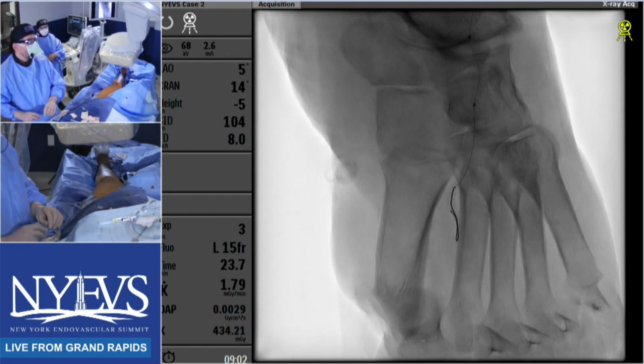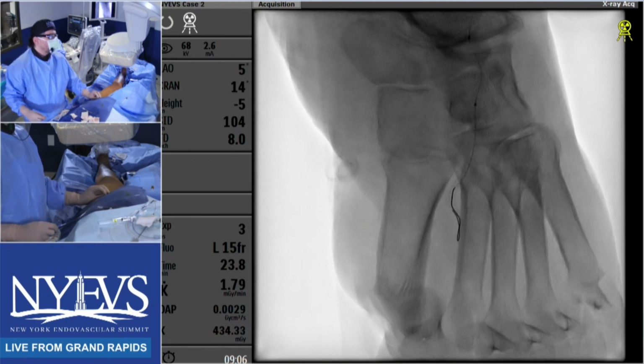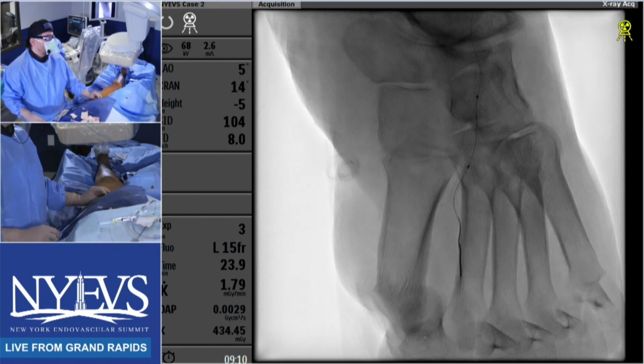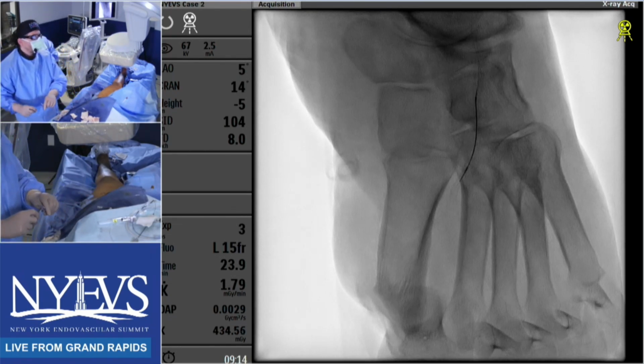Look at that. I'm sorry, Serena, just look at that. This is a coronary 2.0 balloon, and it's not crossing. It just crossed right now. I'm going to take a picture here. Yeah, go ahead and do the talks, and I'll switch.